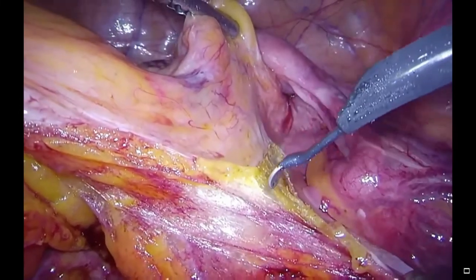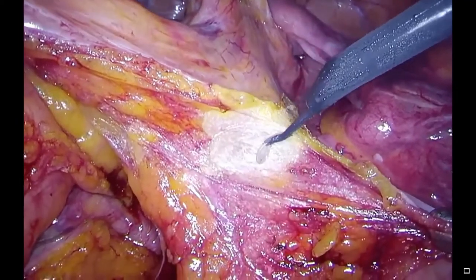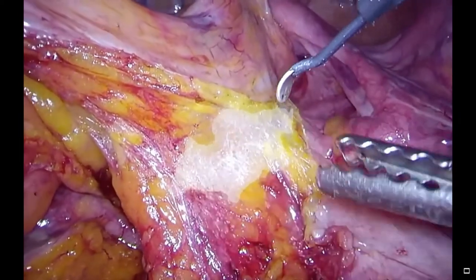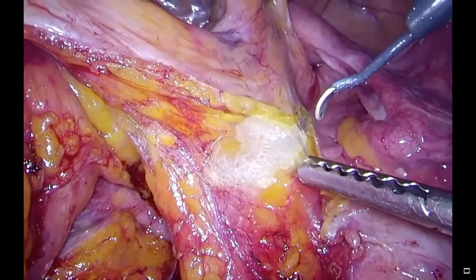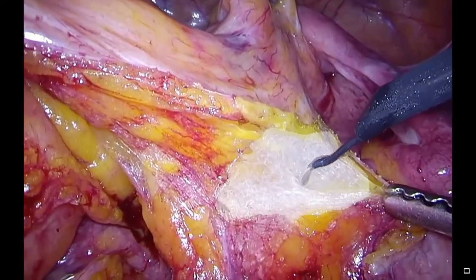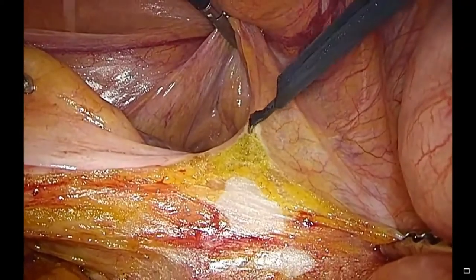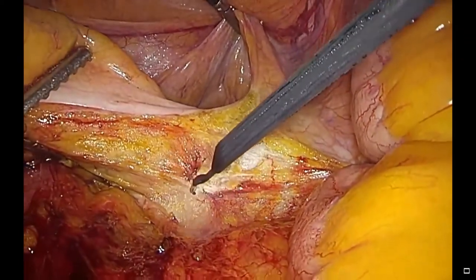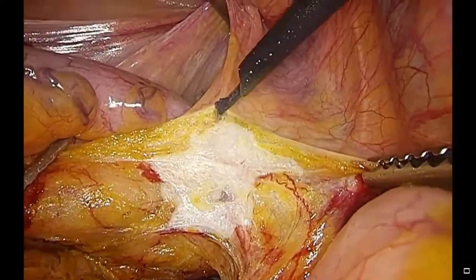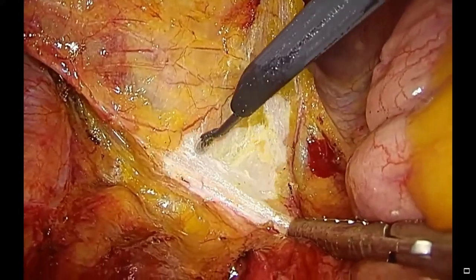It could also preserve the autonomic nerves required for the maintenance of urinary and sexual function. This model could locate and highlight areolar tissue to be dissected for TME. Therefore, the complete TME procedure could be achieved by simply dissecting along the highlighted area. We can easily select the dissection line on the inside or outside of this plane.